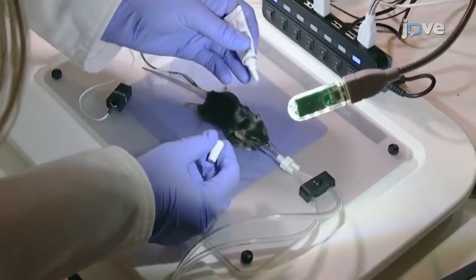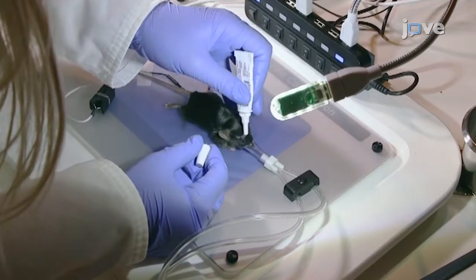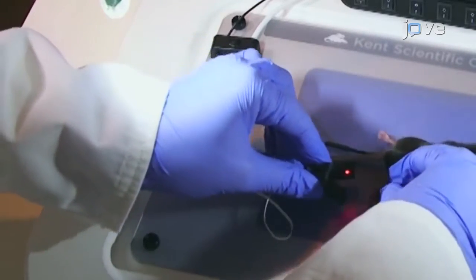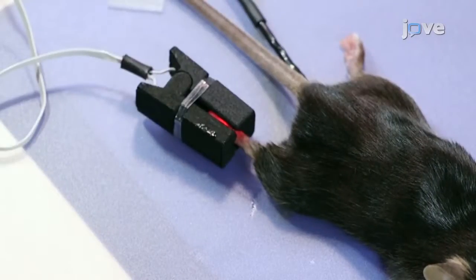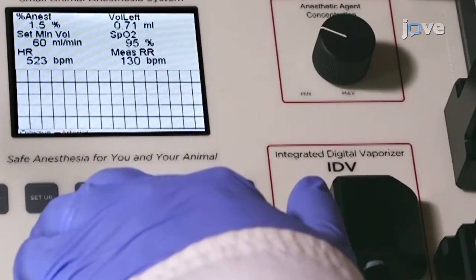Apply ophthalmic ointment to the eyes to prevent dryness during anesthesia. Begin physiological monitoring by placing the sensor over the pad of the hind paw. Position the sensor so that the red light illuminates the paw. Display the oxy wave in order to visualize the sensor signal.